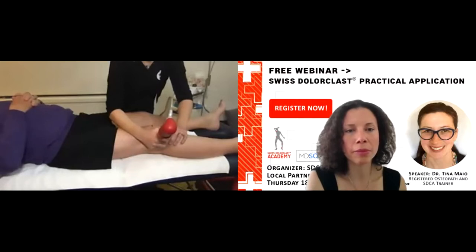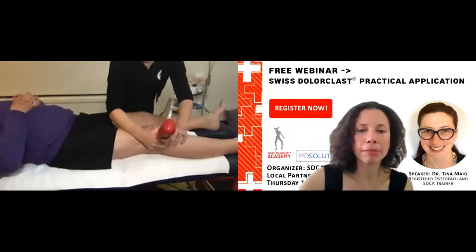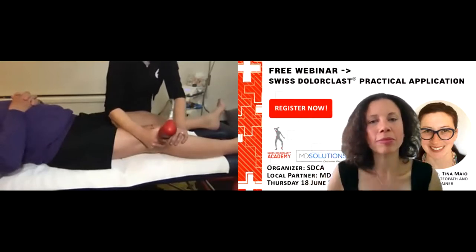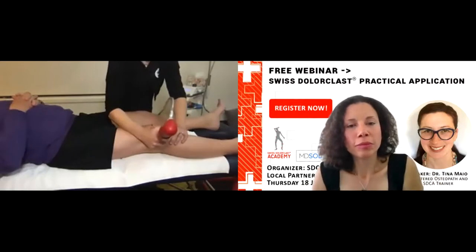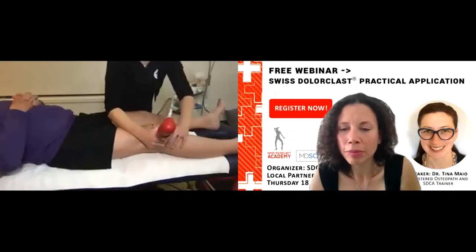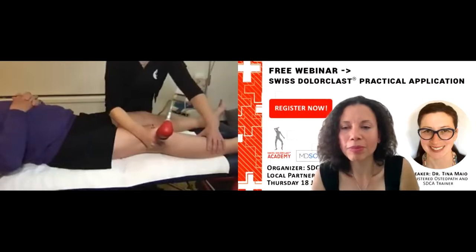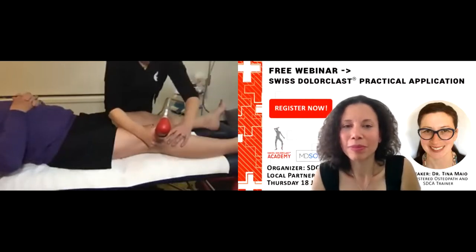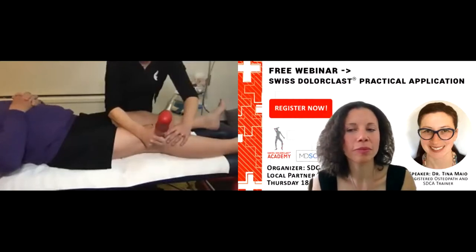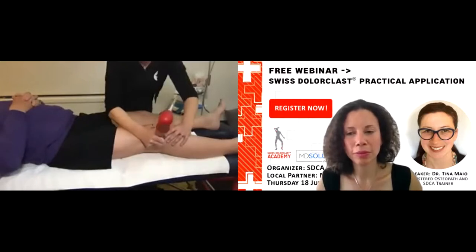You okay there? Yep. You're doing very well. Good. So I'm just keeping an eye on the delivery of my waves, because I want to deliver, as I said, all around these 6 different positions. Are you getting any referred pain? No. Good. So I'm moving up and down the joint line to distribute as much of that shock wave all along the lateral joint there.